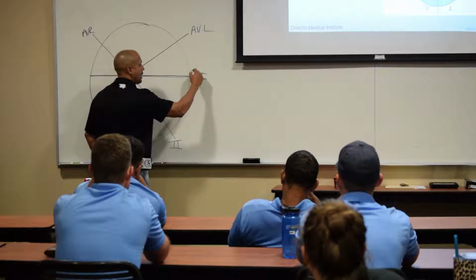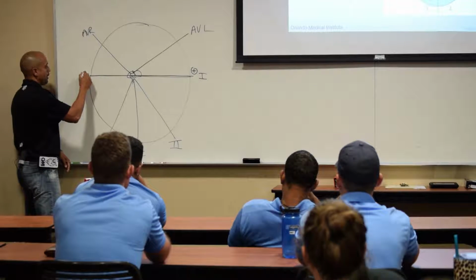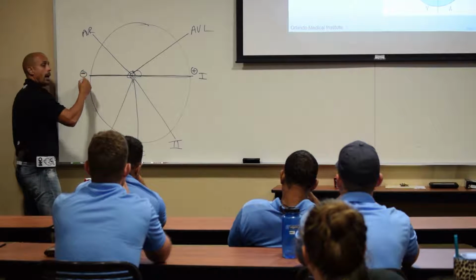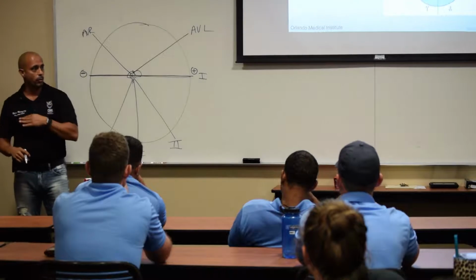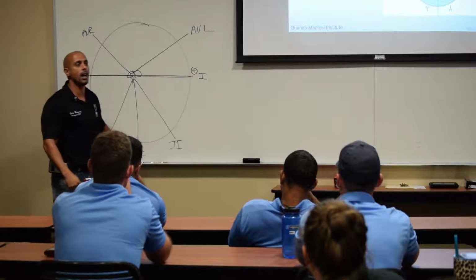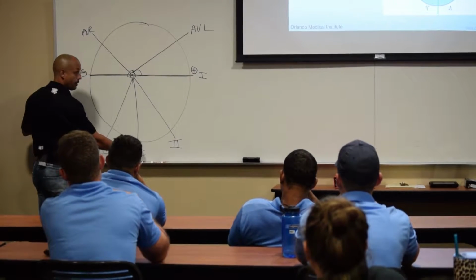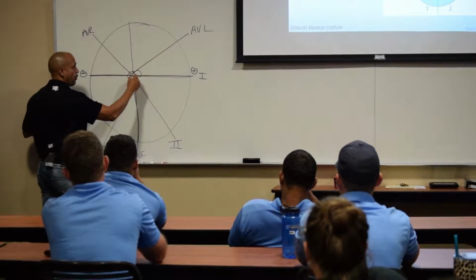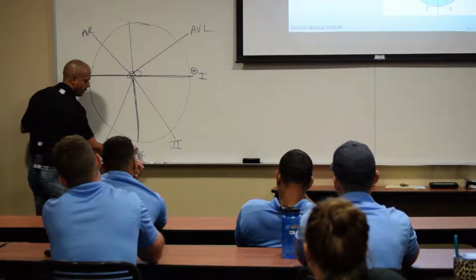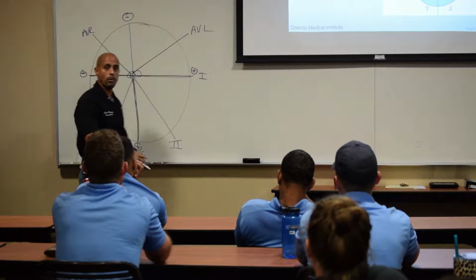Absolutely. So guess what it's here? Positive, right? So if this is positive, where's the negative? The opposite side. So if I went from the Wilson Central Terminal this way, I'm looking towards the negative. You with me? So did that cut that in half? Top to bottom, right? What's the other lead that would cut left to right? Directly. AVF. So if I go from the Wilson Central Terminal down, what's this right here? Positive or negative? So that means this is what? Negative. Everybody with me so far?